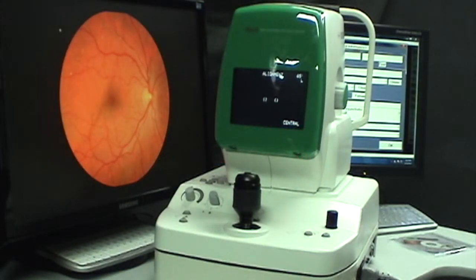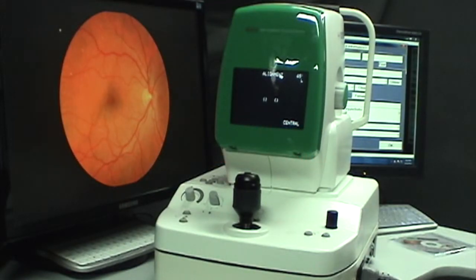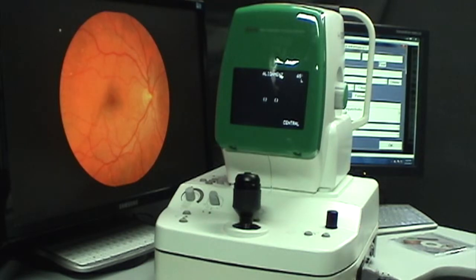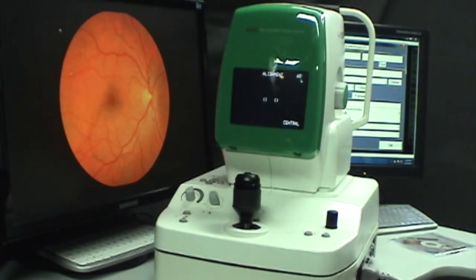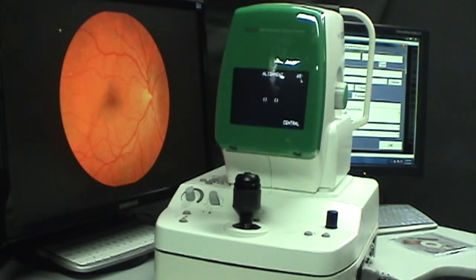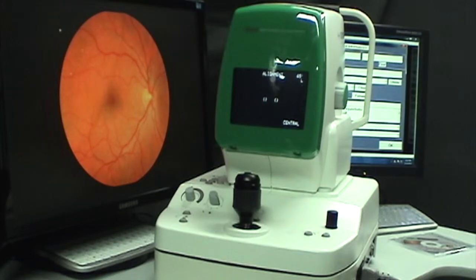If you have a COA non-mydriatic fundus camera similar to this one and you're having a problem with your patient fixating in the wrong place when you're trying to take their photo, chances are the right-left indicator is not changing on the camera. I'm here to help you clean that sensor and solve that problem.